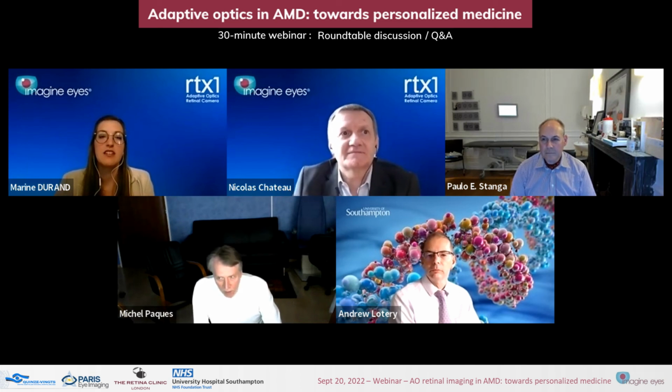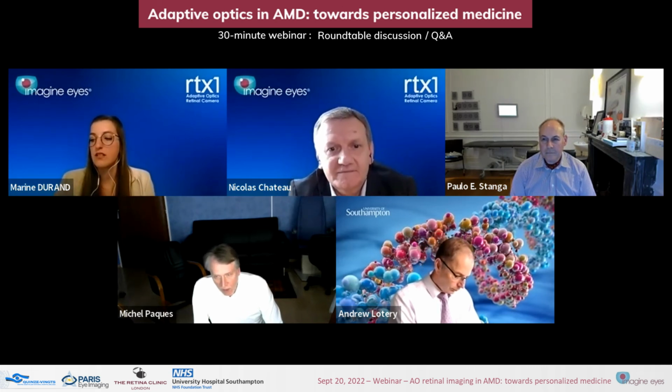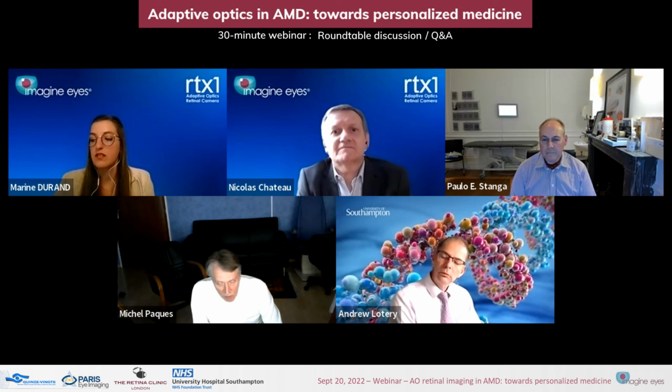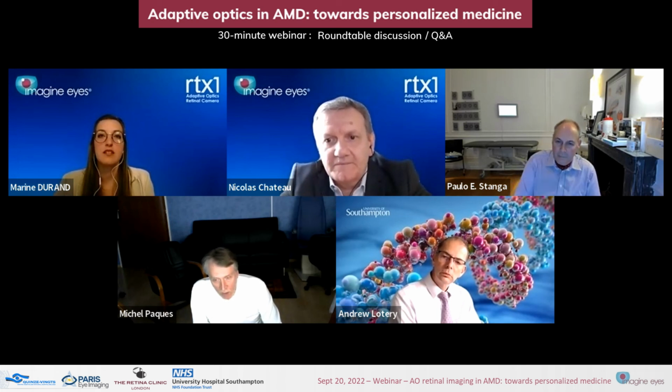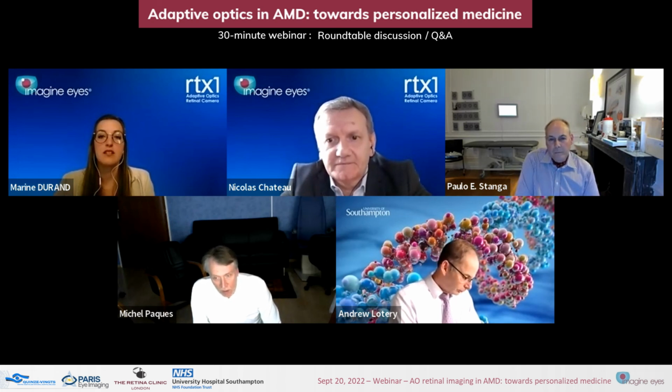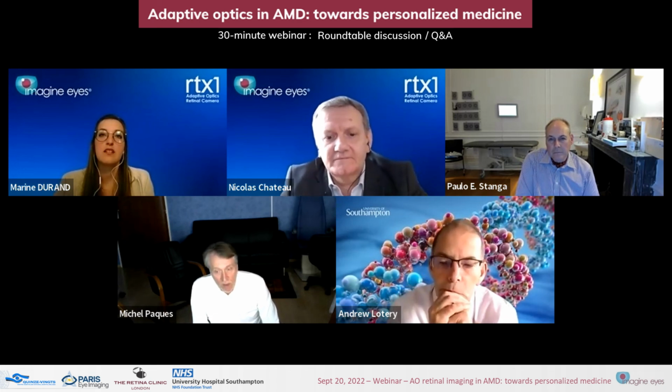If you're talking about a single image, which is, let's say, the daily problem of these patients, we expect that there is a correspondence between the number of pigment spots that we see and the presence of inflammatory cells, because histology done in particular here in Paris show that most of the pigment spots, the melanin spots that you can see dispersed in GA cases, are located in macrophages. So it seems logical to think that the more pigment there is, the higher the activity is. This remains to be proven. It's not yet demonstrated clearly.